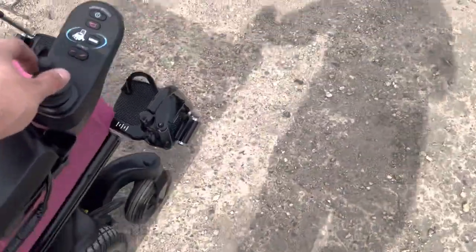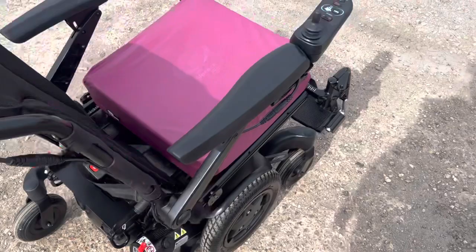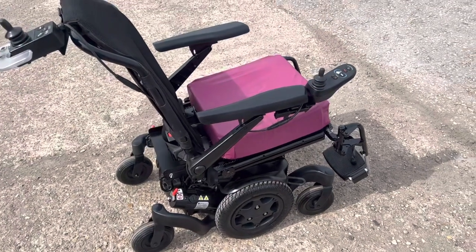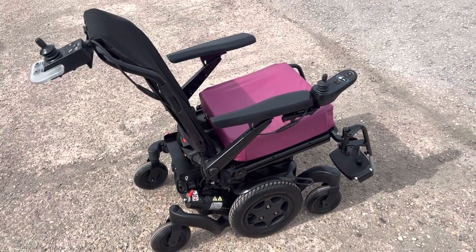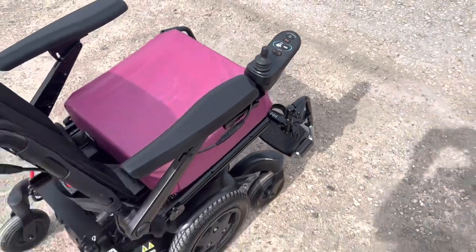It's a four mile-an-hour top speed — it feels like six but it's definitely four. If you want any more information let us know in the comments below and we'll get back to you as soon as we can. You can also visit our website at www.healthx.store.